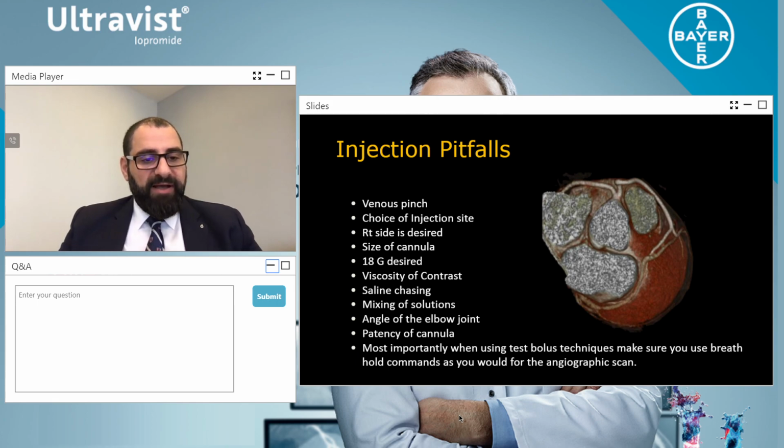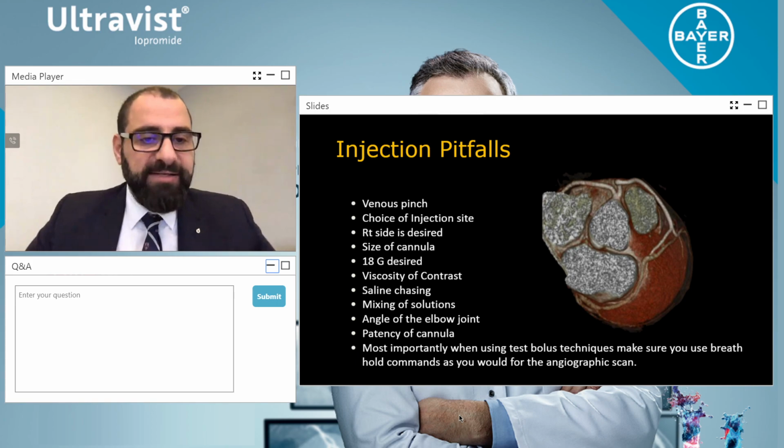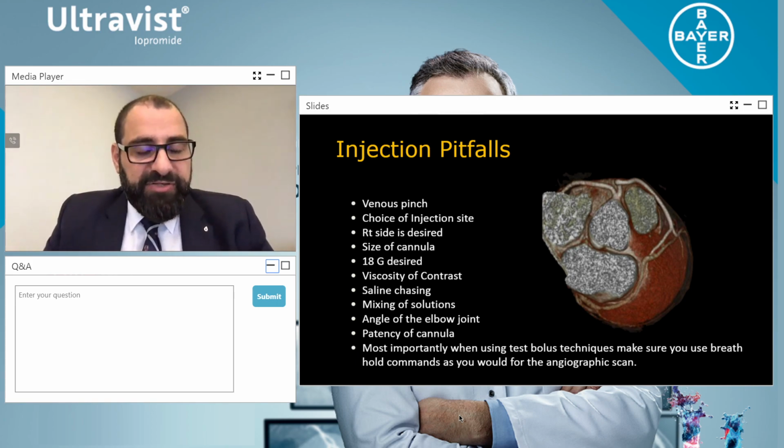Now we have Sarah Lim who says that since the liver could be a dense organ because you could have increased iron in it, how will it affect the image quality of the liver parenchyma when you reduce KVP? Absolutely fantastic question. So remember when we said that when we're looking at lesions, we look at the lesions relative to the liver parenchyma.